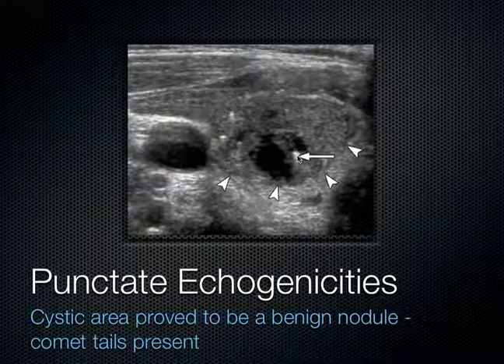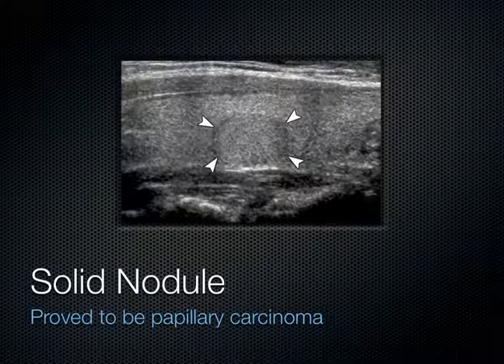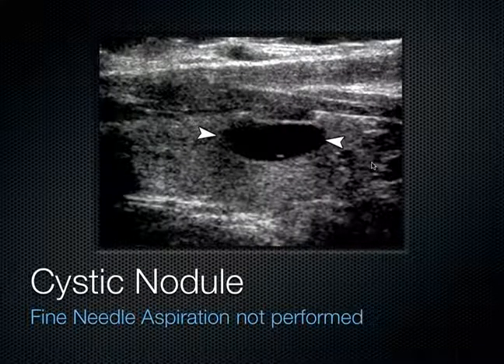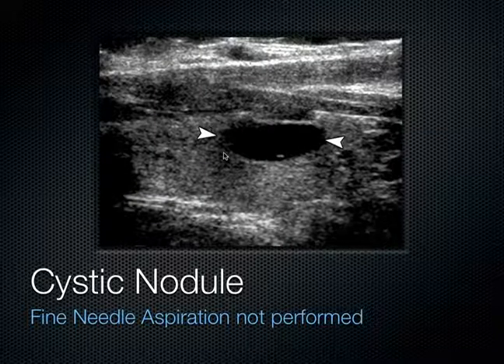Here's another example of punctate echogenicities in the thyroid nodule — a transverse view with arrowheads outlining the nodule. This echogenic structure had a comet tail artifact with it. When you see a comet tail artifact associated with a hyperechoic punctate lesion, you're more reassured. Going back one slide, those are hyperechoic bright dots without a comet tail — more concerning for cancer. This one with the comet tail turned out to be benign at biopsy. Another sagittal view of another thyroid mass turned out to be papillary carcinoma, confirming you really need to biopsy these to know for sure.